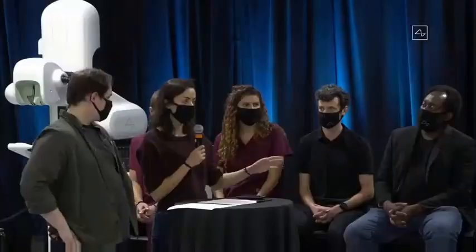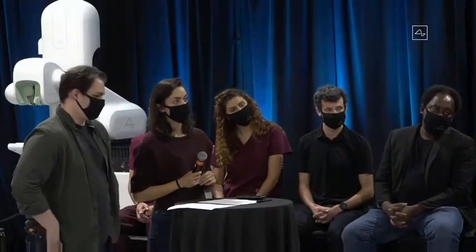We are planning on modifying the device and the robot to be able to sew into arbitrary depths of the brain. Right now, we're limiting ourselves only to the cortical surface because that simplifies many of the problems involved with going a lot deeper. And what kinds of things can you solve on the cortical surface versus when you go deeper? Sure. A lot of the low-level processing happens in the cortex in terms of motor intention and sensory information that comes directly in. So your hearing, your auditory percepts, your visual processing, a lot of that happens in the cortex.